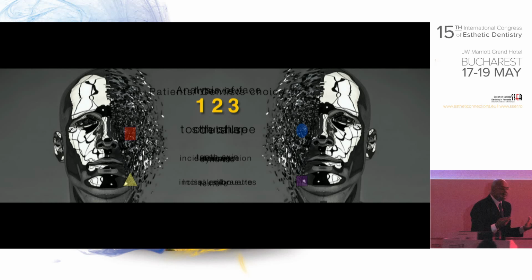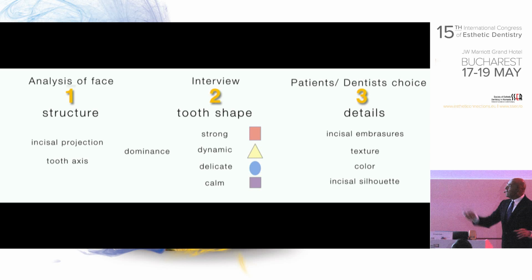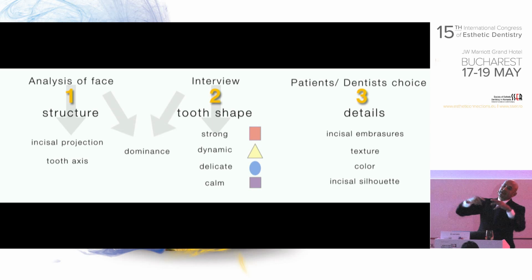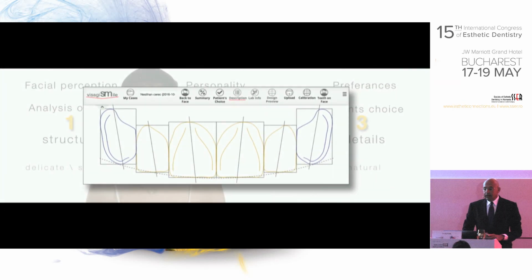And behind those simple two things, there's a very complicated software which consists of all these issues relating the face to the structure, relating the interview to the tooth shape, their combination with the dominance and the details, whatever the patient is asking for. And it gave me this design.